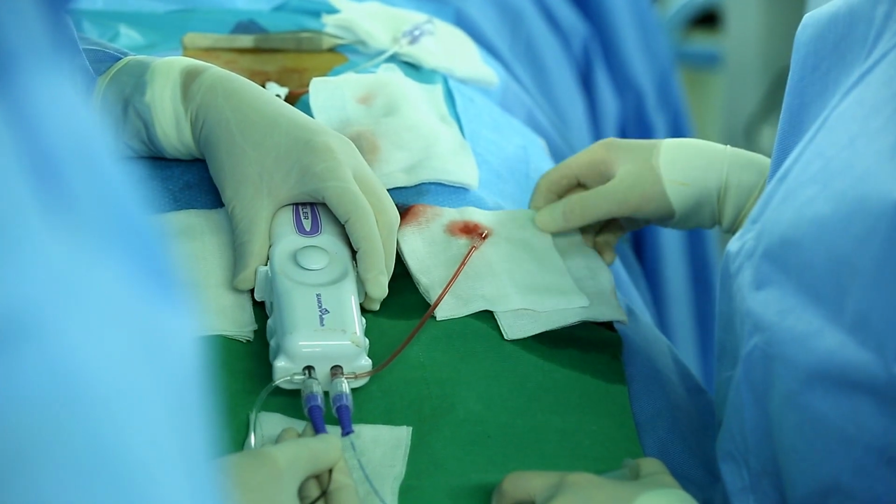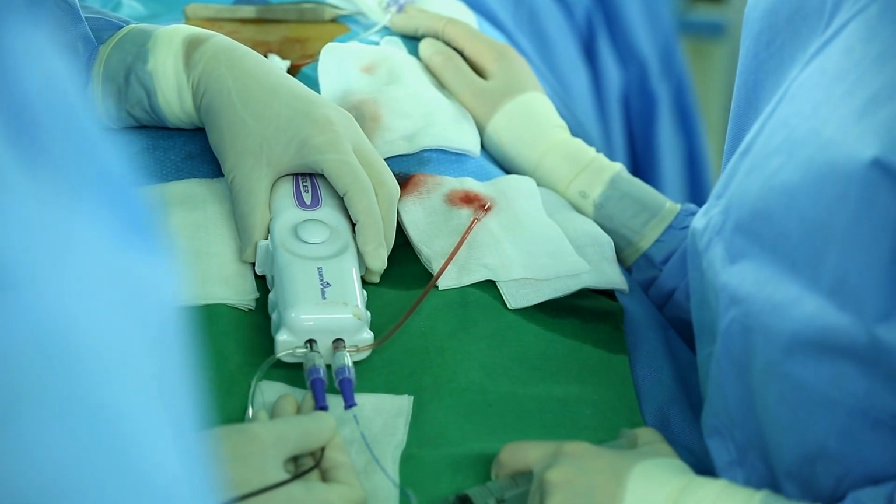If the patient during SELD complains of neck pain, most of the pain's cause is coming from the increased epidural pressure. Then you should stop the operation for a while and remove the cap of the drain tube. Then, place the patient in the head up and leg down position. After the pain is gone, you may continue SELD.